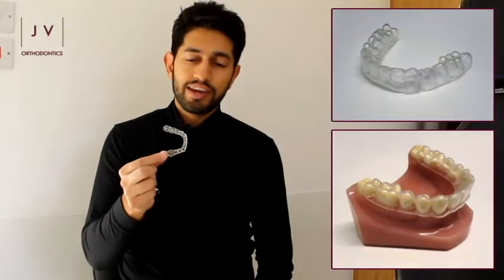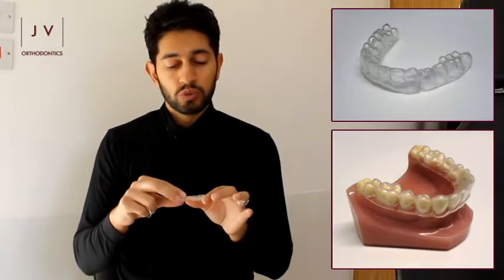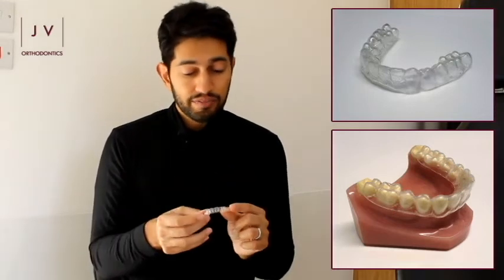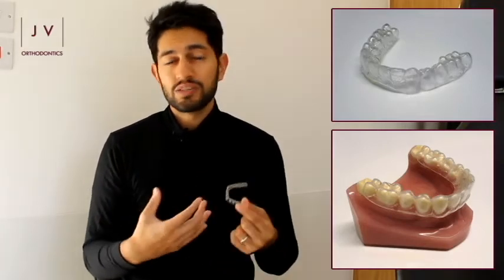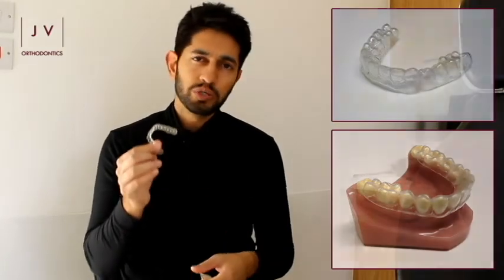This clear retainer fits snugly over all your teeth and doesn't have any metal components because it engages the undercuts on the teeth. The benefits are it's less visible; however, because it covers the biting surfaces of your teeth, some patients who grind or clench their teeth at night can sometimes wear through these a little bit quicker. Of course there are lots of other types of retainers available as well, and if you're not sure what would be the right retainer for you, the best thing to do is speak to your orthodontist and ask them.